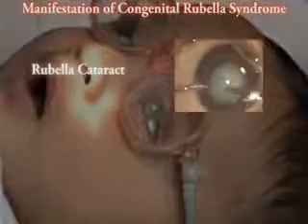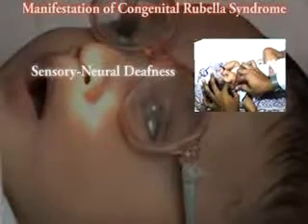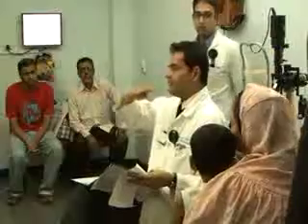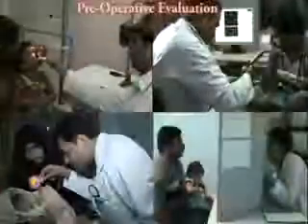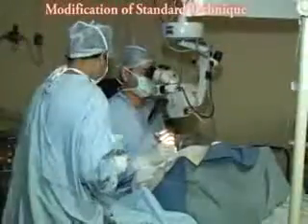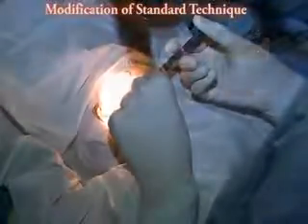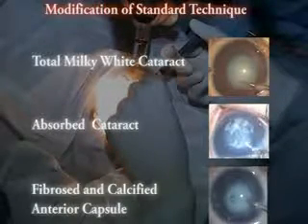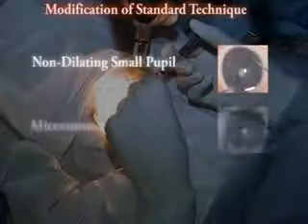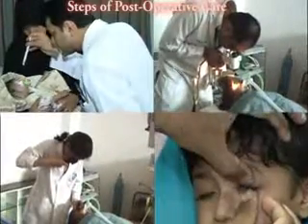The common manifestations of congenital rubella syndrome are congenital cataract, congenital heart disease, commonly patent ductus arteriosus, sensory neural deafness, and rubella retinopathy. A systematic approach for the management of congenital rubella cataract will be illustrated here. The pre-operative evaluation, modification of standard technique of pediatric cataract surgery in difficult situations such as total milky white cataract, absorbed cataract, fibrosed and calcified anterior capsule, non-dilating small pupil, and microcornea, as well as the steps of post-operative care will be demonstrated now.